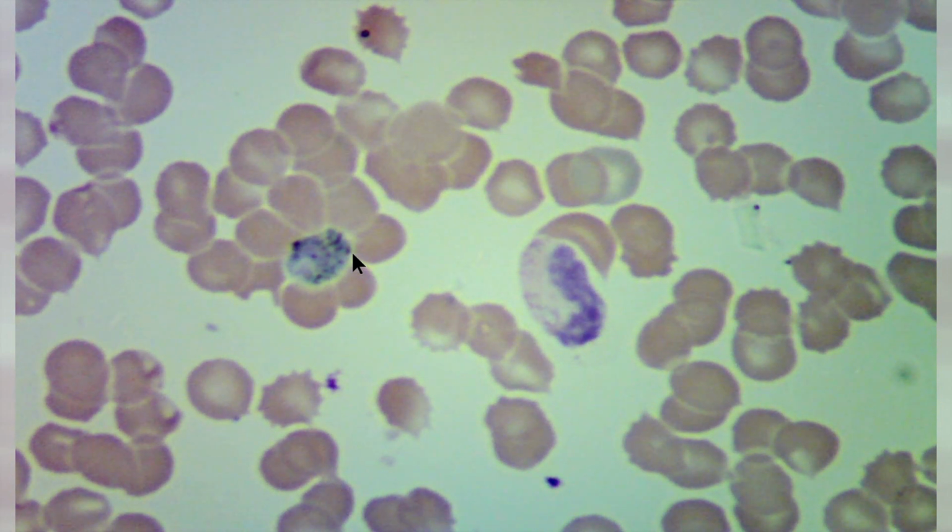There are 5 different species, and each species, even though it has an overall similar cycle, presents itself differently on the blood smear. And it becomes very technical to be able to identify the exact species of the malaria because of the similarities and differences that they have in different stages. This stage is the Schizont stage, in which the parasite is getting ready to break the boundaries of that red blood cell that was infected, and the reason that it appears like that is because it's devoid of hemoglobin, because the parasites have used up all the hemoglobin.